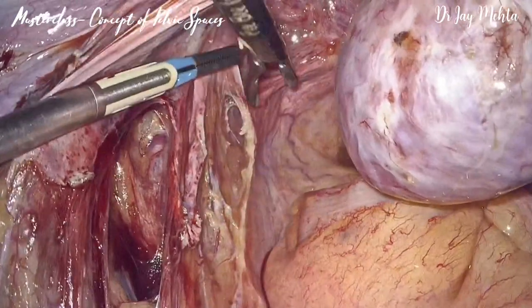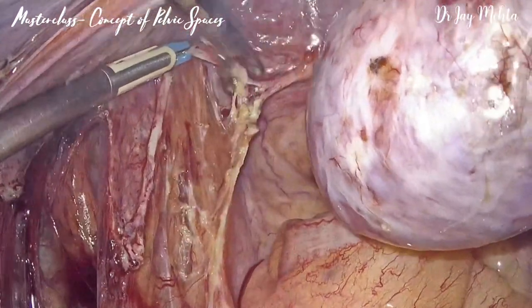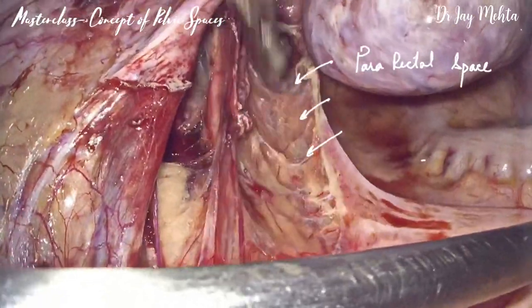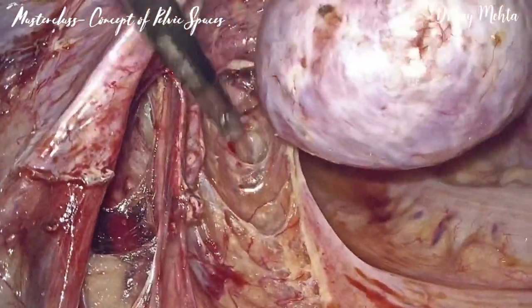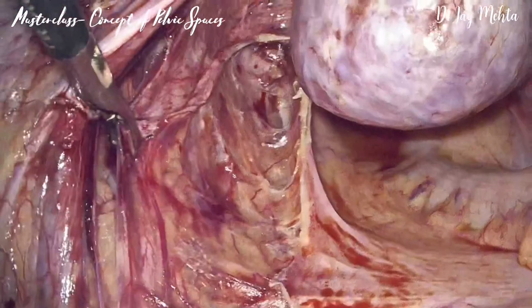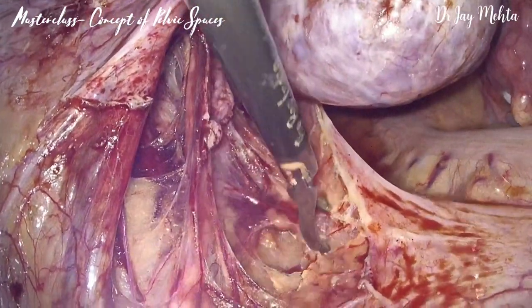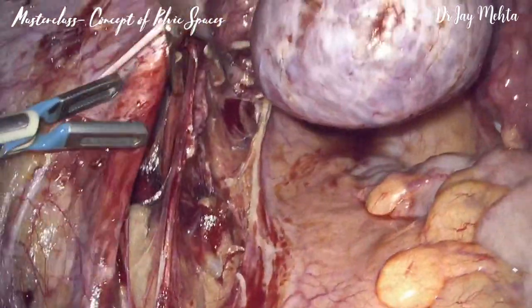Currently the plane of dissection is medial to the ureter. We are opening up the space which merges with the lateral rectal spaces and the anterior rectal space, which we also call the Denonvilliers fascia. You can see the rectum — as soon as traction is given onto the rectum, the pararectal space opens up further. This allows mobilization of the ureter in a lateral direction, ensuring extreme safety of the ureter especially in cases of severe endometriosis. Opening in this plane, the first plane we identify underneath is the retrorectal plane. You can see that all these planes actually merge with one another.